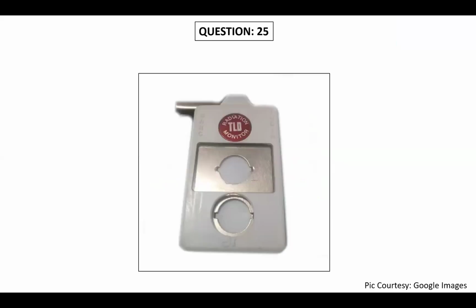Madam, any idea about this instrument? TLD, sir, thermoluminescent dosimeter. It's a personal monitoring device, based on the phenomenon of thermoluminescence. Very good. And it has three windows.